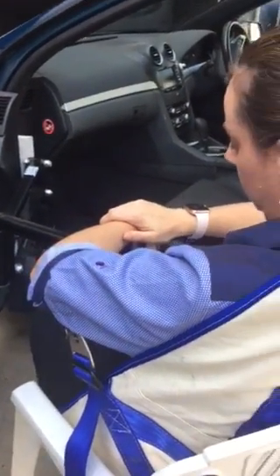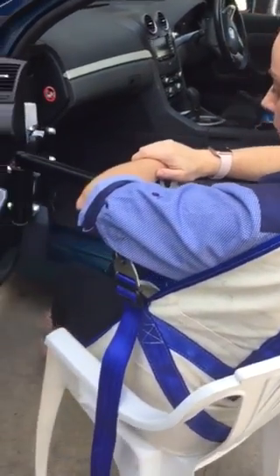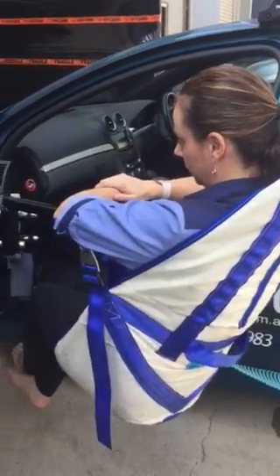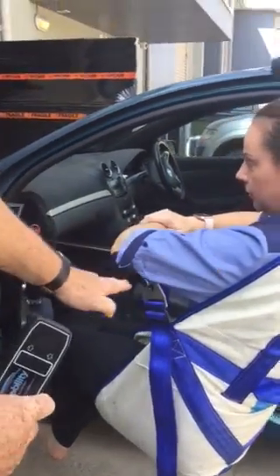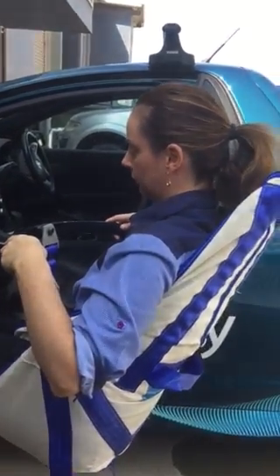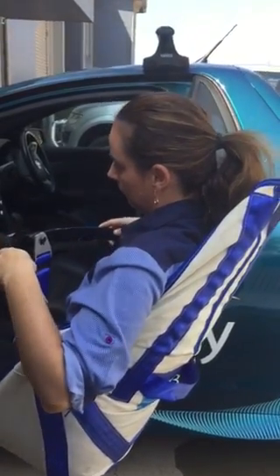Now if I lift Tanya up, you'll see that Tanya's lifting off the seat up to the stage. I can now remove the chair, and you'll see that the chest bar is roughly in line with Tanya's chest. It's not up around her head. I can now lift her up to make sure that we are in a position to enable us to clear the seat of the car.